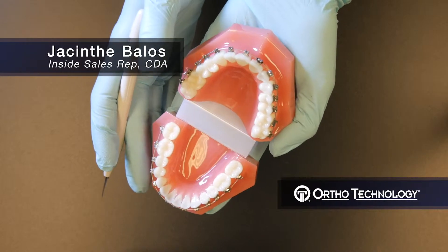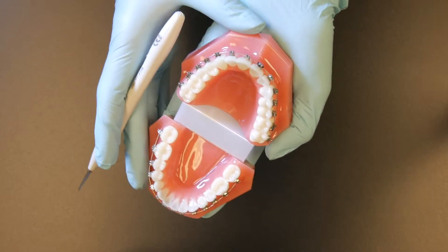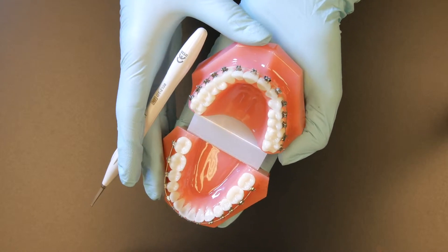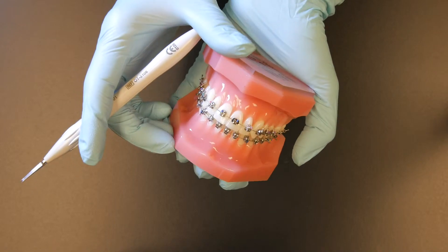My name is Jessaint. I'm an international sales representative for OrthoTechnology and a certified dental assistant. This is our Lotus Plus DS self-ligating bracket. It was invented by an orthodontist.